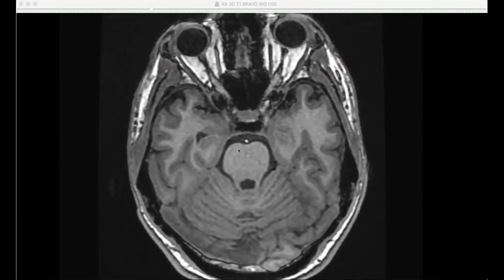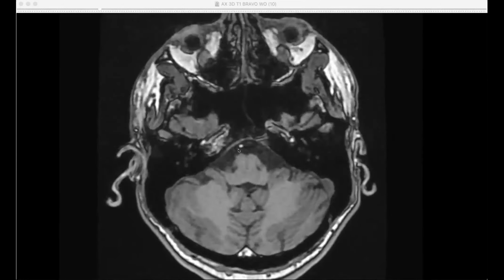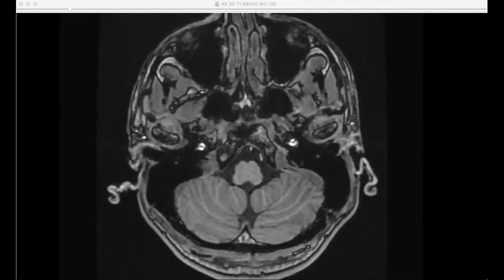So what happened to blood from arteries, where it comes from? Below. Outside of the RF excitation. And so the thing is, we knock the spins, they come back, we knock the spin. So you create T1 weighting, right? But the arterial blood didn't see all this knocking and rising, just fresh magnetization is being knocked and produces very bright signal because of that. But then as you move up in the head, it's starting to get knocked more often, and then its signal is going to be reduced. So you only see this bright arterial blood vessel at the bottom of the head as opposed to being on the top of the head.